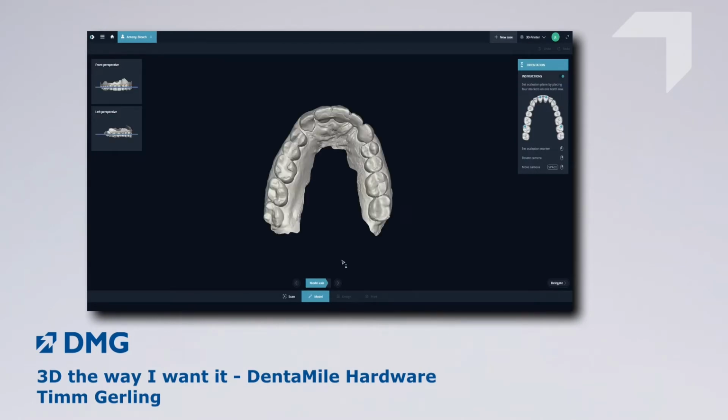After the upload, we go immediately into the next step, into the designing step, and here we need to define the occlusal plane. This is required for the correct orientation of the bleaching splint. When we've created the occlusal plane, we go into the next step where we do the design of the reservoirs.